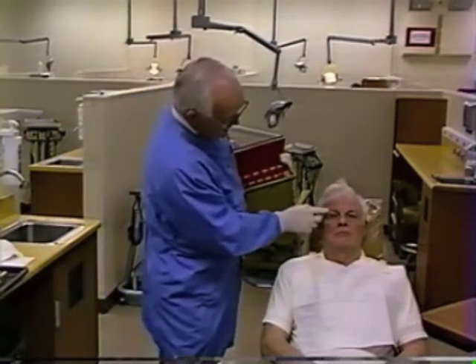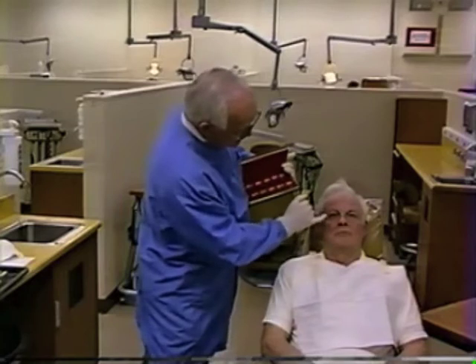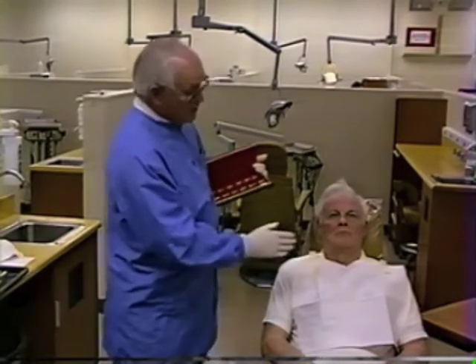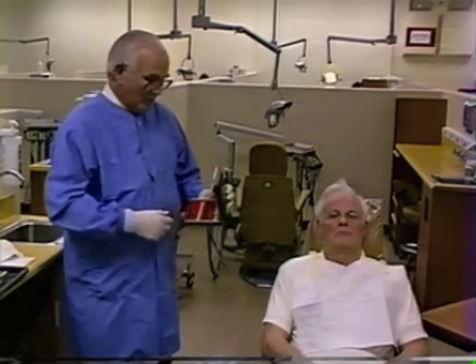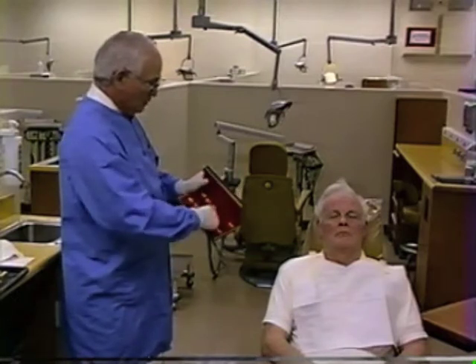One other thing to consider is whether the hue of teeth should be in the yellow range or the gray range. Patients with brown eyes and a little brown sclera will tend to have more yellowish shades of teeth. Patients with gray or blue eyes will generally tend more toward the gray shades. So we're going to consider his eye coloring, complexion, and age to find a compatible tooth. I'll start in the middle of the top row and get a couple of shades from the bottom row for comparison.